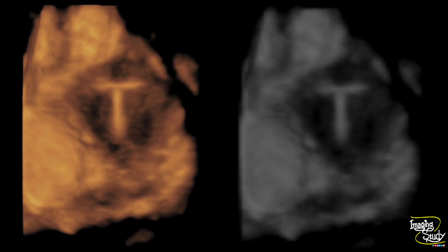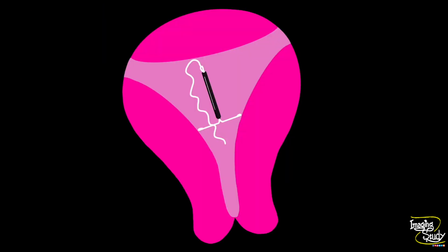If you do three-dimensional ultrasound of the uterus — whether transvaginal or transabdominal — you can easily understand the normal orientation and position of the intrauterine contraceptive device. You can see this T-shaped appearance is well visualized here. This horizontal part should obviously be present at the upper part of the uterus.